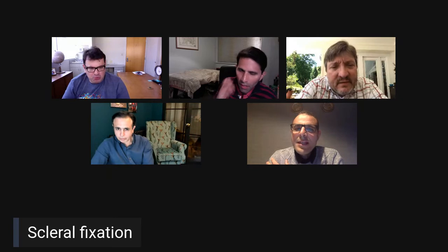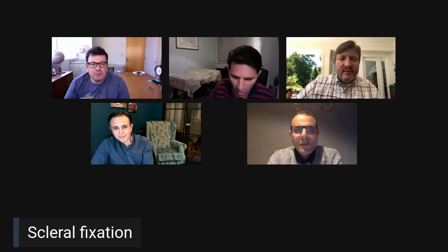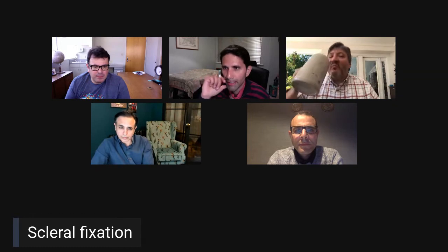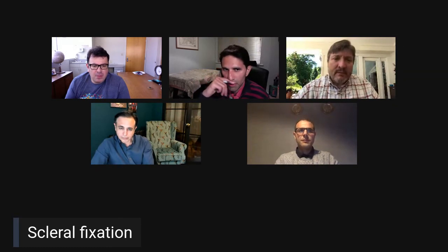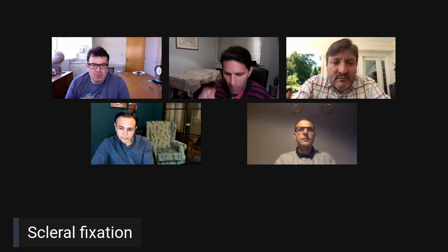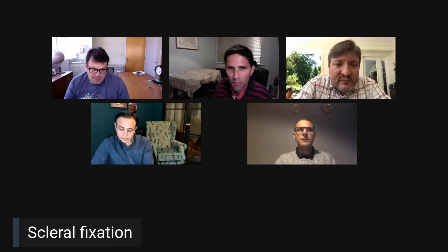It's interesting what you say about UGH. I've had the misfortune of having to deal with a few of these things, and UGH is a real thing, particularly with these square edge lenses, and it's very frustrating because it causes a lot of damage, and it does make me think. You know, these lenses are not made for these purposes.